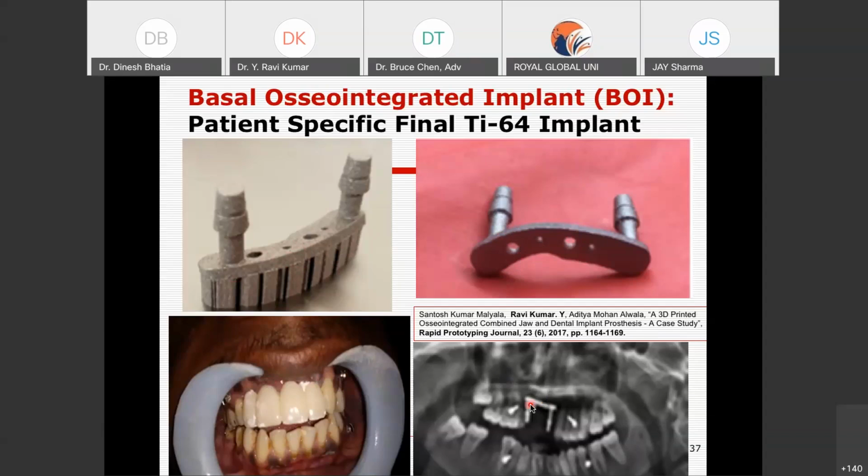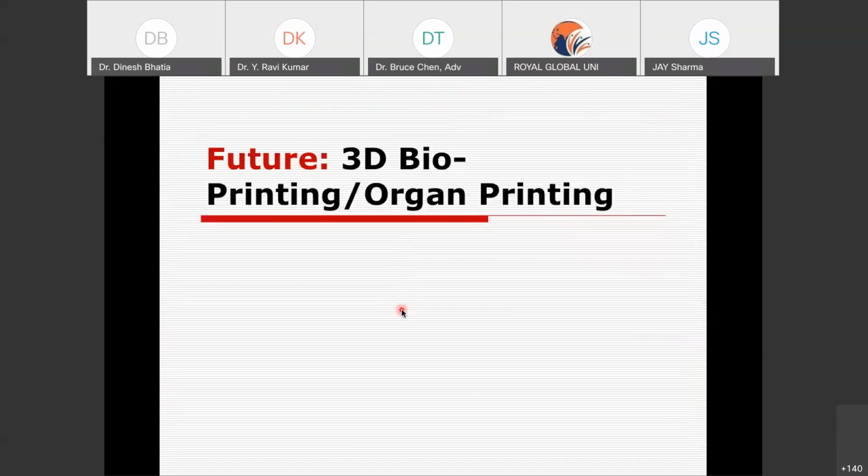of that implant. So in this way, where your standard implants have not worked out, we need to customize the implant as per the patient's condition. Then we need to design and fabricate them and then implant them. In this way, the 3D printing technology is quite impressive in these kinds of situations where we don't have a conventional solution, and 3D printing comes to the rescue, so you can perform under these situations.